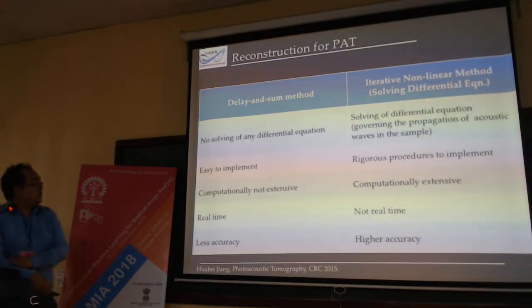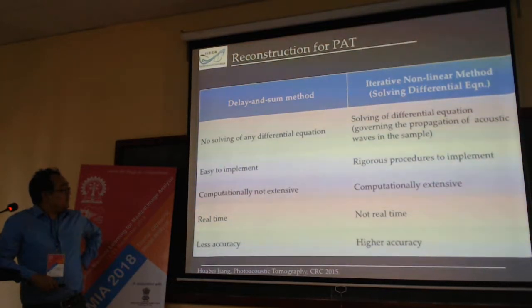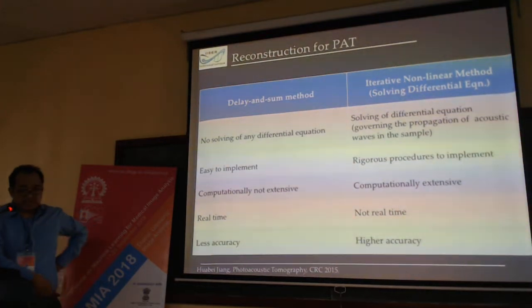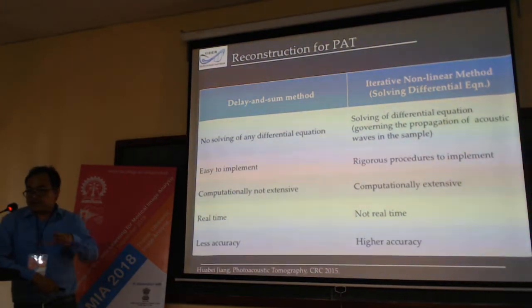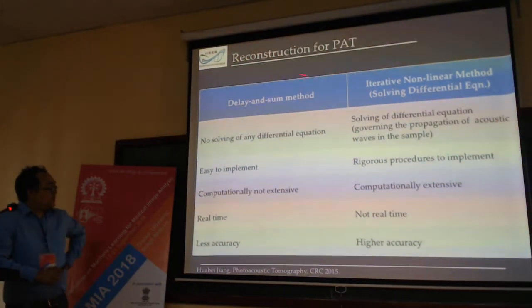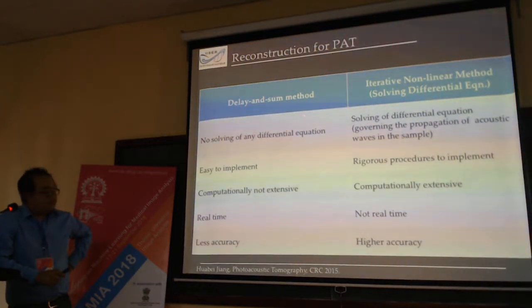For the reconstruction of the data, there are two methods, which I will come to after this. Typically they are of two types. One is delay and sum, or beam forming.